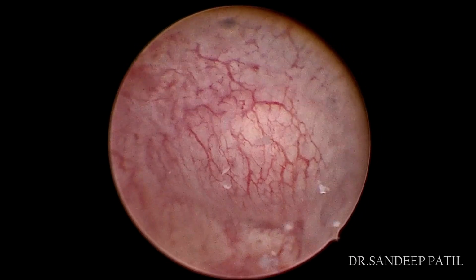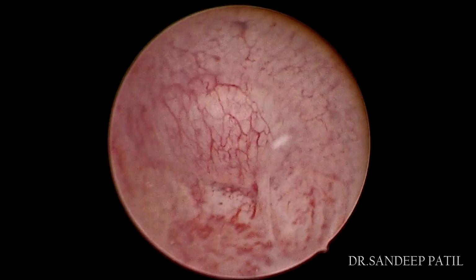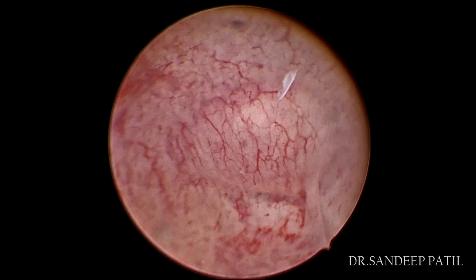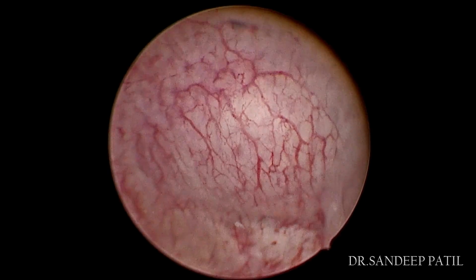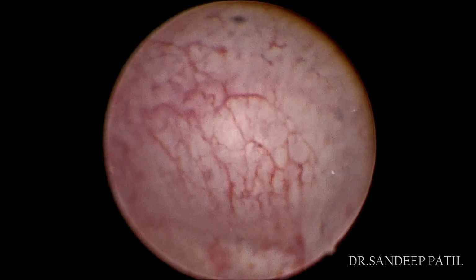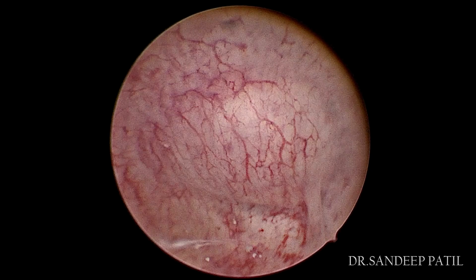This floating debris is nothing but shredded necrotic tissue or endometrial flakes, which may be seen in conditions like endometrial hyperplasia, endometrial atrophy, infection, and after hormone withdrawal bleeding. It obscures the field, and that's the only nuisance, and if we stay there for some time it gets cleared off. At the max we need to adjust the focus of our hysteroscope just to fine tune the vision.